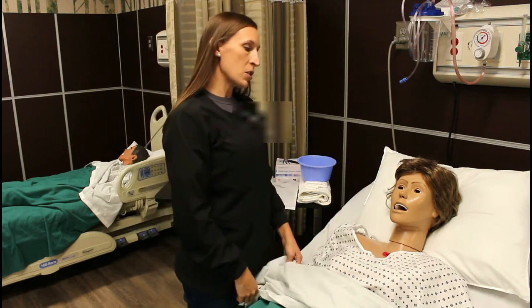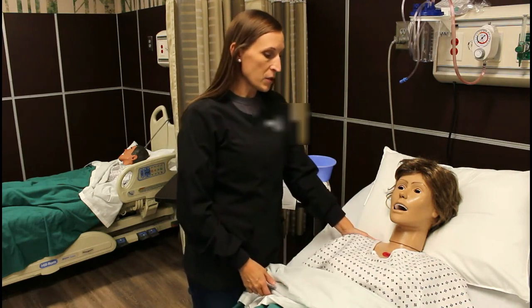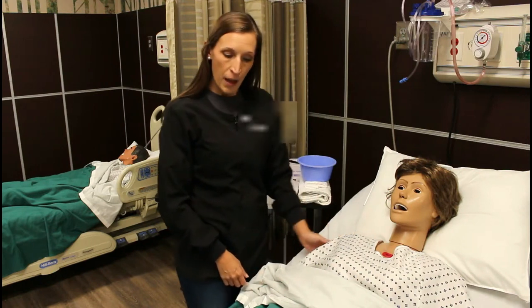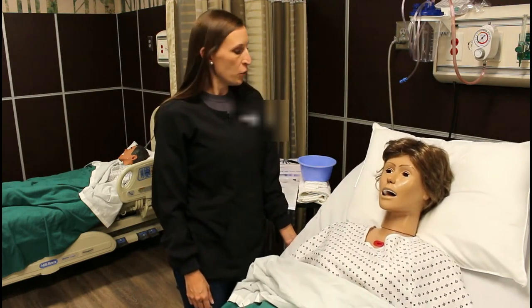Today I'm going to put in an NG tube. That's what your doctor ordered to help decompress your stomach, get some of that fluid off, and it'll help you breathe easier as well if we relieve some of the fluid that's there in your belly. First thing I'm going to do is raise the head of your bed and ask you a few questions.